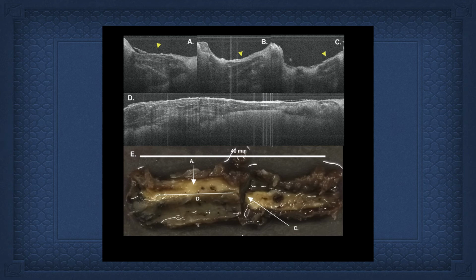And this thing is not in one axial plane. So you know at the bottom of an OCT image, you see the longitudinal section, which I'll show in the next slide. But if you look in one axial plane, these things spiral. So it's not going to give you the true length. You have to look at it in more axial planes. You actually have to follow it.